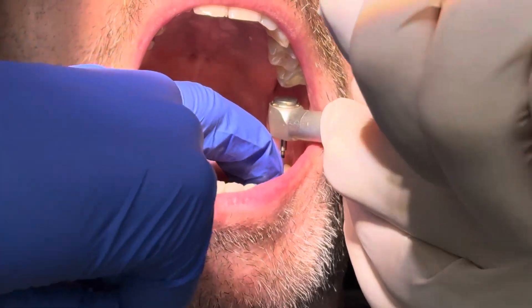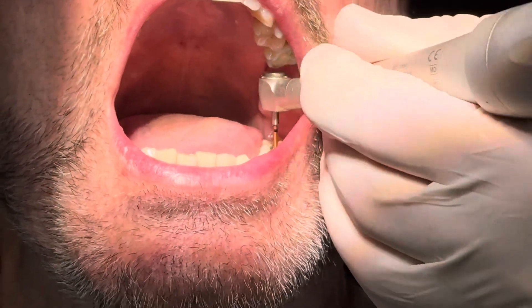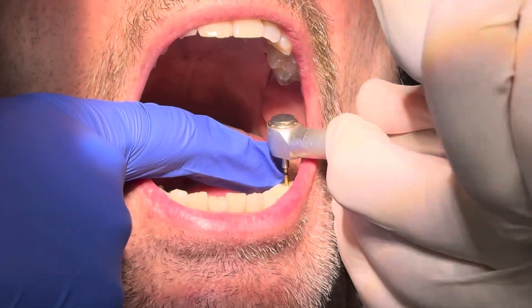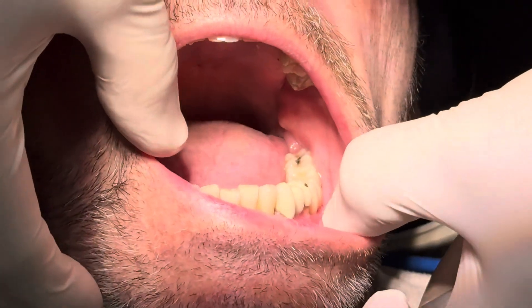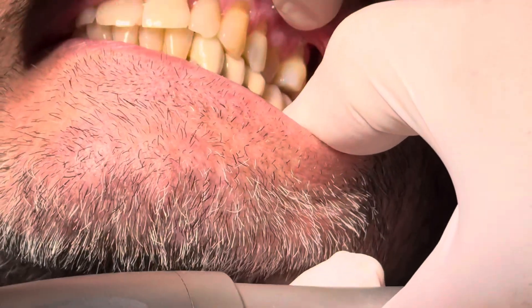We're going to tighten the OmniGrip mini screws to 20 Newton-centimeters according to manufacturer's recommendations. As the torque wrench finishes it will click and tell you that you're at 20 — I preset this to 20 prior to putting it in the patient's mouth. A very important step.